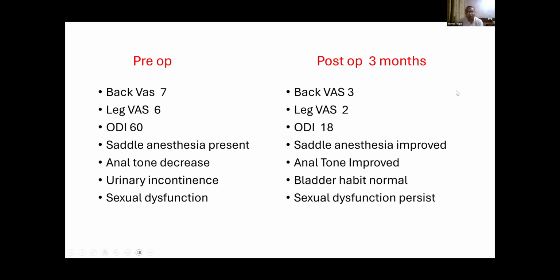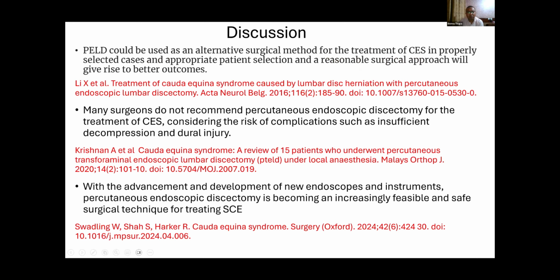Next, please. So there are many articles on whether cauda equina syndrome should be treated with endoscopic or with open laminectomy or microscopic microdiscectomy. There is literature both for and against, but with the advancement and development of the new endoscope and instruments, percutaneous endoscopic discectomy is becoming an increasingly feasible and safe surgical technique. So next, please.